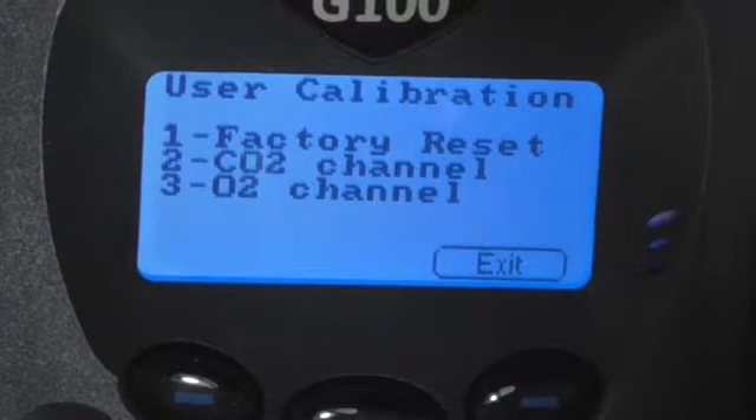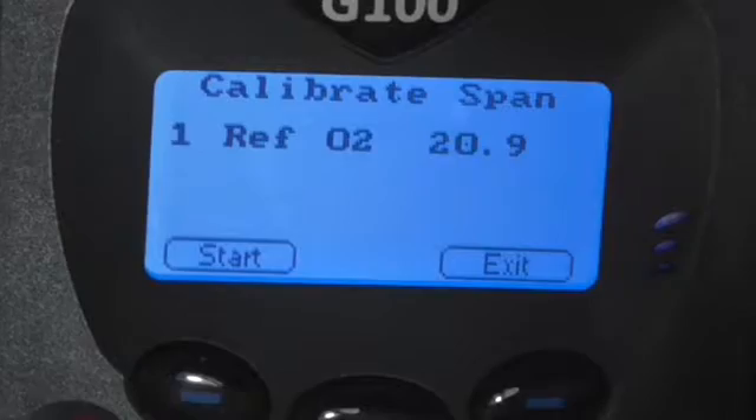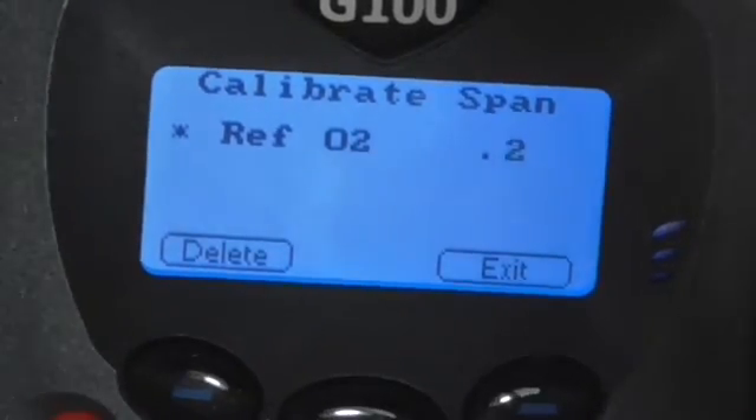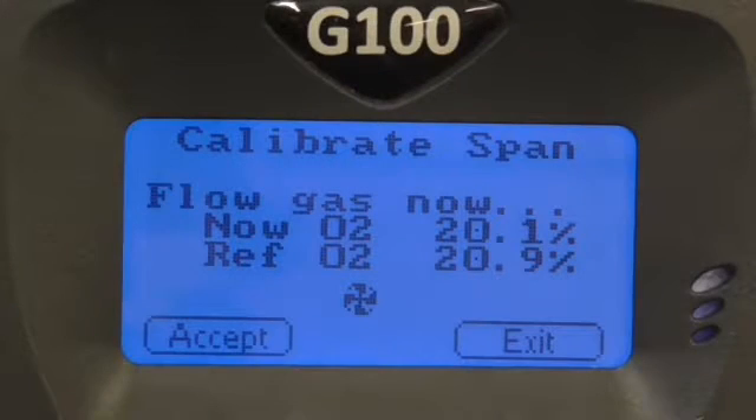If your instrument is configured with oxygen, press exit, select 3 for the O2 channel and enter your desired span gas level. If span gas is not available, fresh air can be used as a reference, which is approximately 20.9%. After you have entered the O2 level, connect the gas to the inlet port, flow gas and press start. Wait for the NOW O2 reading to stabilise before pressing accept to maximise accuracy.